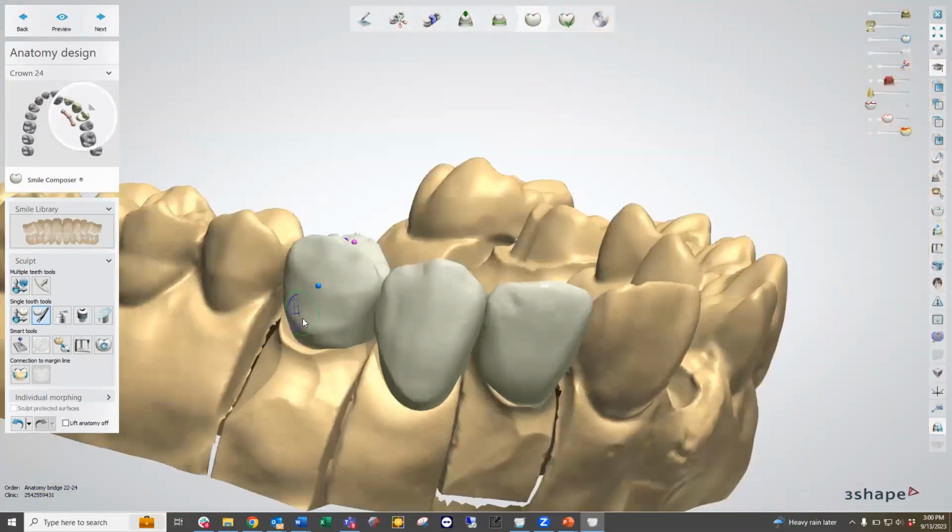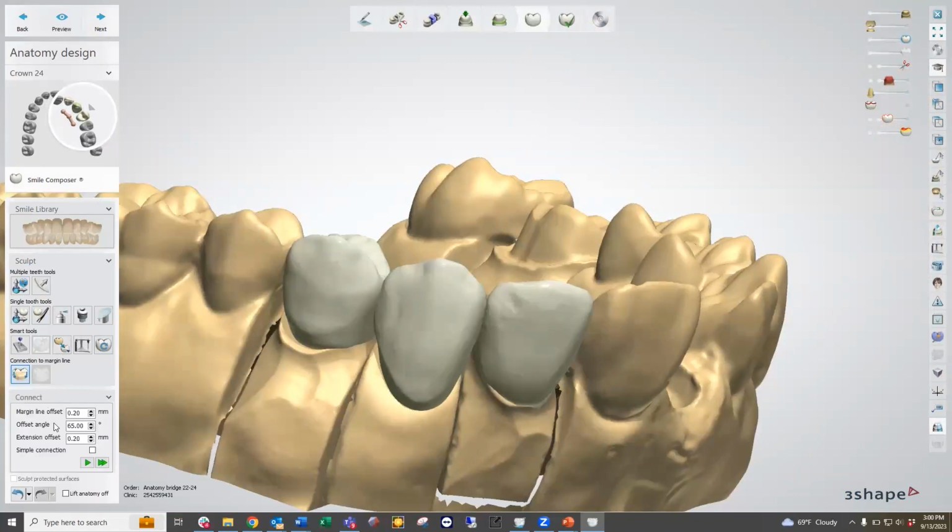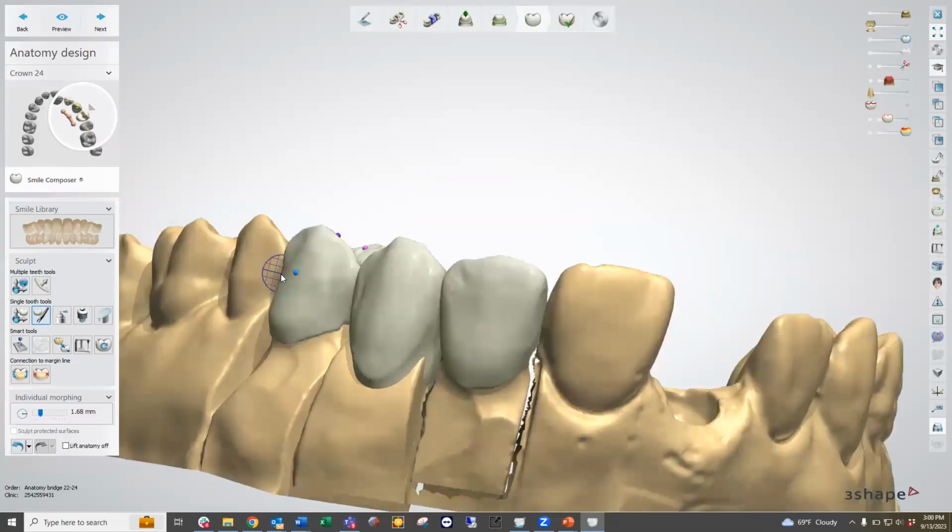Now with the 2 crowns over here, we can see that those will attach nicely to a margin line, but we notice with that pontic, there is no connection to the margin line. That's because we have a different setting for the pontic. So first, we're going to apply these settings. I'm going to apply to all, so it applies to both my lateral and my bicuspid, and then make any necessary changes as needed.